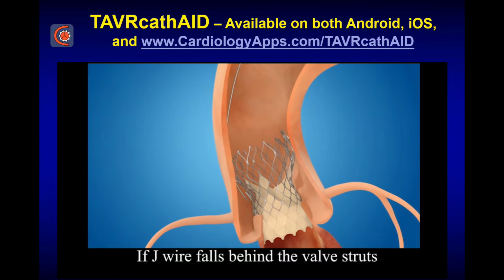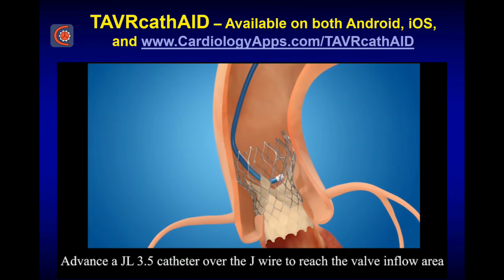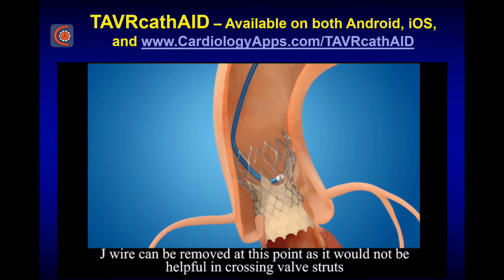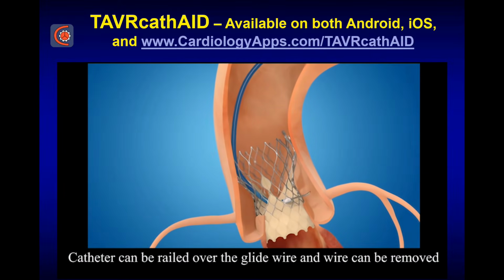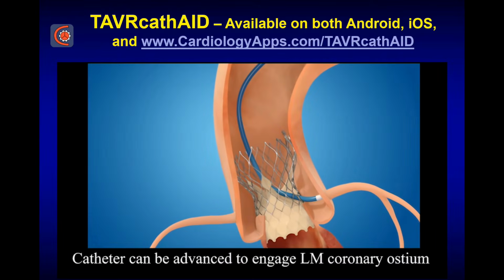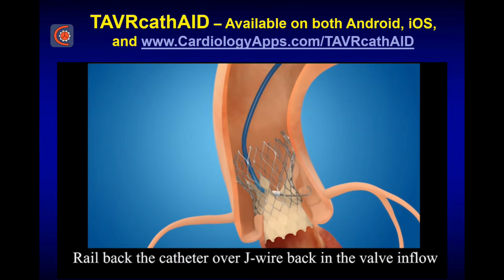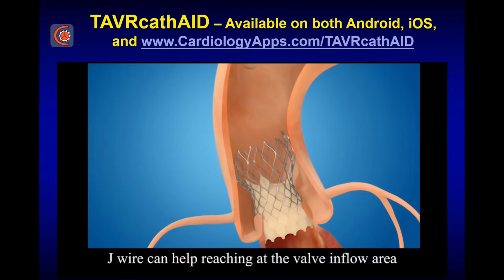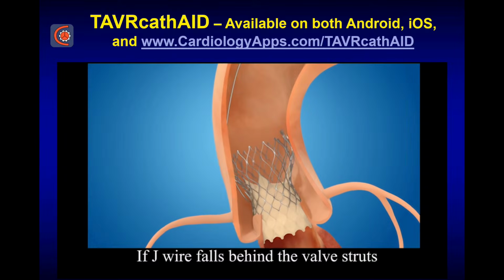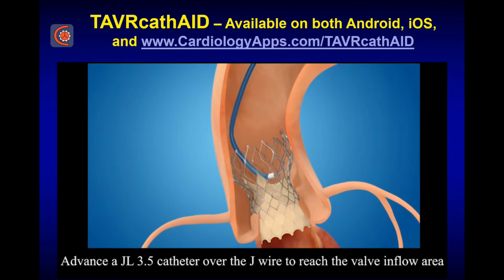If you see here, exactly the way I showed you, use the J wire, and very important, you go into the valve with the J wire inside the valve. Since it is a smaller catheter, usually it will curl up. That's when you use a wire, without the wire, get into the diamond, and then advance. When you're coming out it is the same; use a J wire. We normally do not, but use the J wire to come out so that you are taking the guide through the diamond carefully rather than aggressively. You can see it once again.